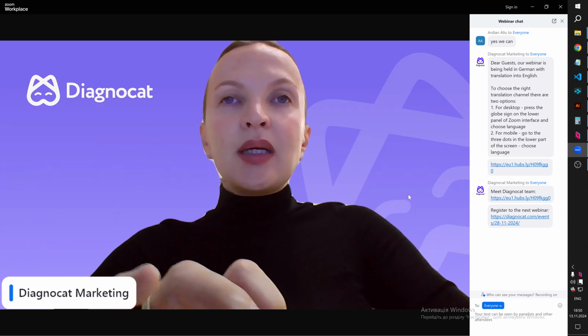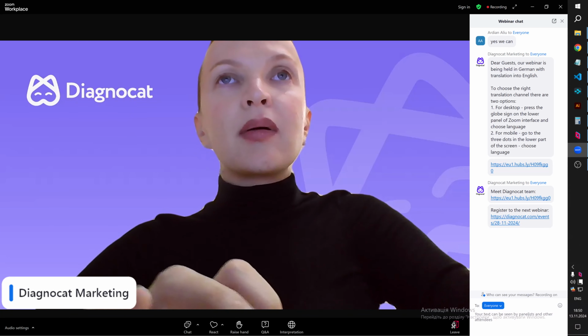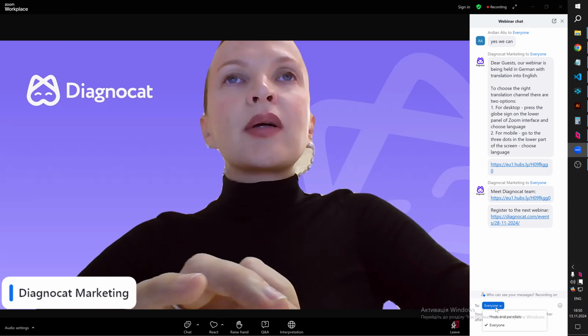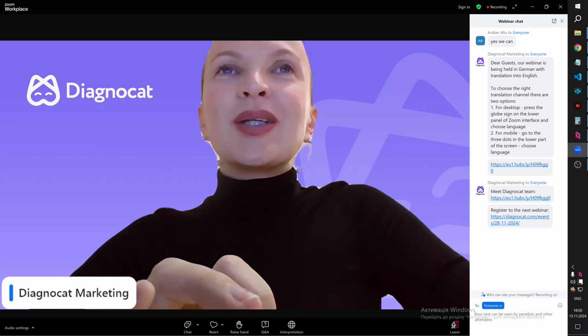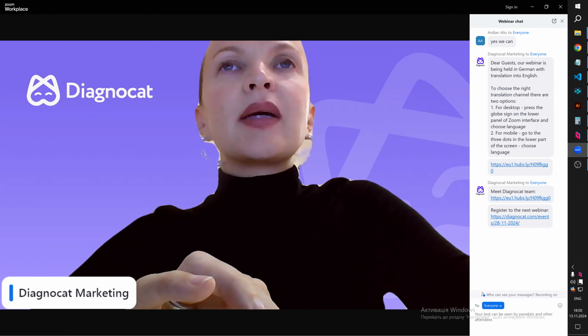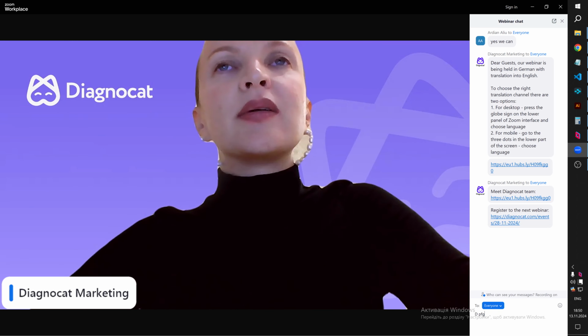So let's see whether we have questions. At least I can see one. I will read it aloud. So the question is, dear Dr. Khan, thank you for your presentation. Does DiagnoCat have the capability to measure the working length for endodontic treatment?